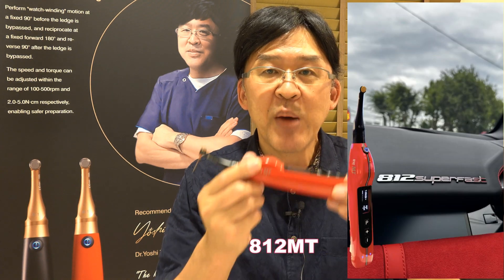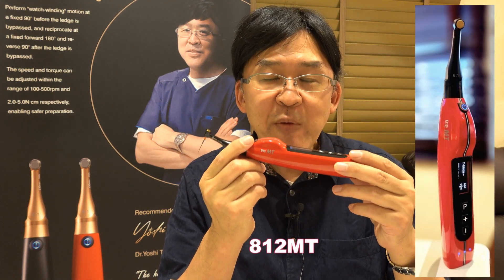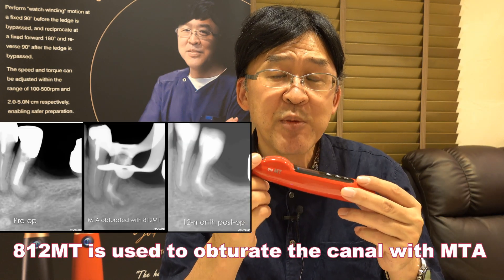Hello, my name is Yoshi Teraguchi. I have developed what we call 812MT. 812MT is used to obturate the canal with MTA.